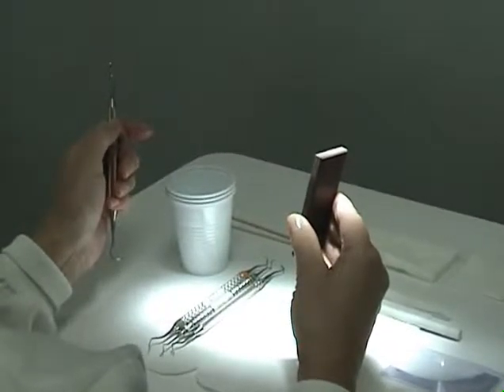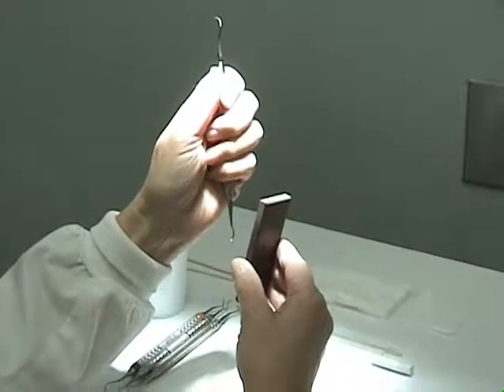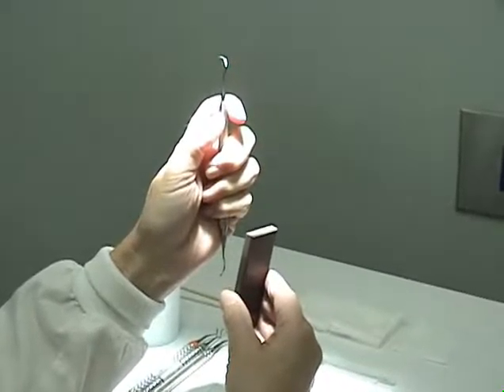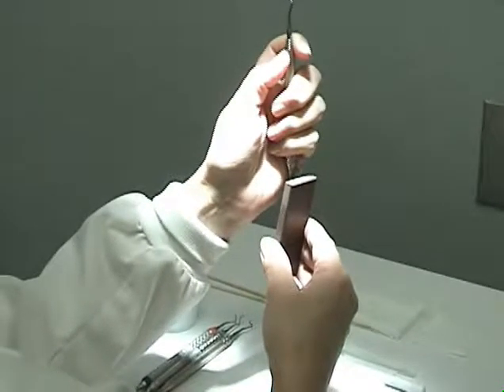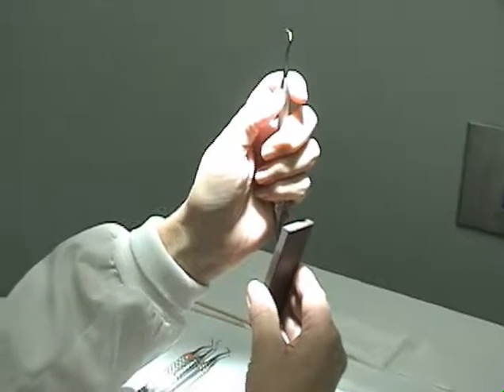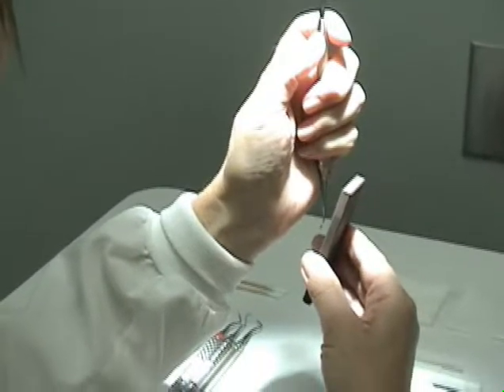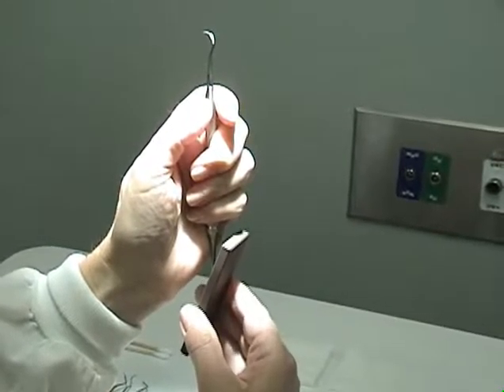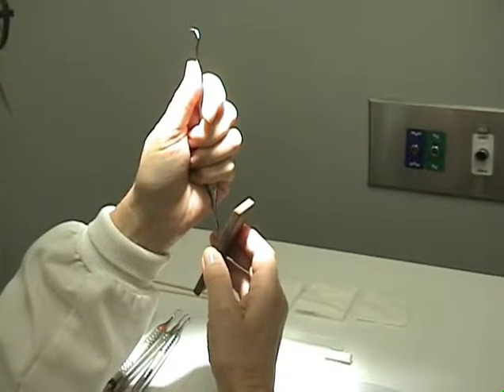The instrument is held in your non-dominant hand with a secure palm grasp. The top of the instrument is braced with your index finger. For universals and sickles, the terminal shank is always at 12 o'clock. The terminal shank is the area between the blade and the first angle. The stone is always tipped toward one o'clock and moved in an up and down overlapping motion.